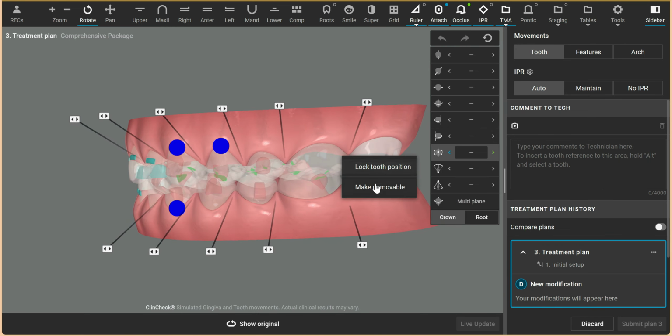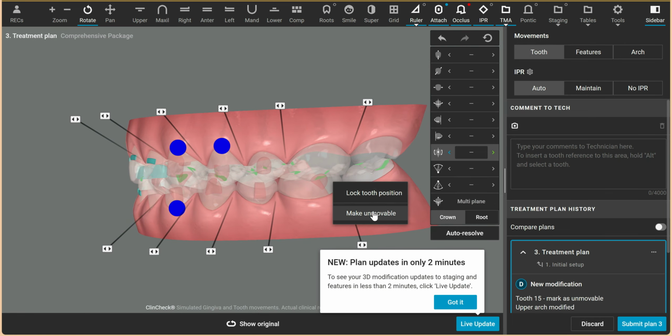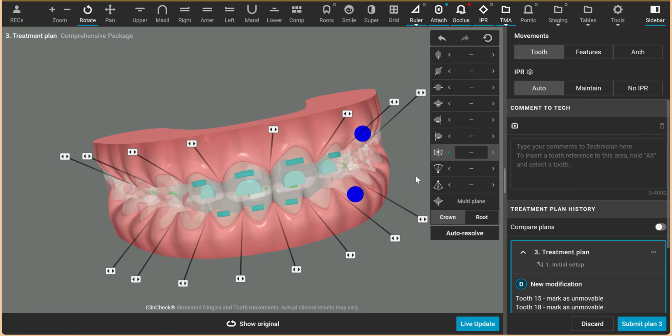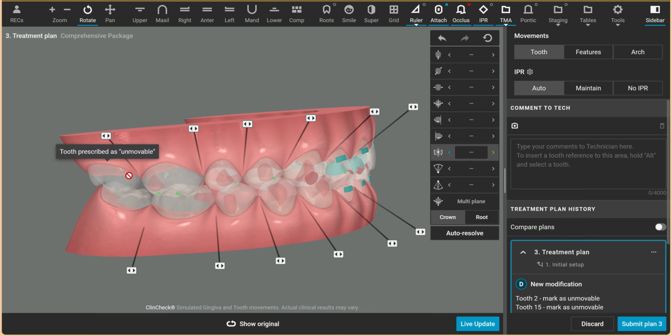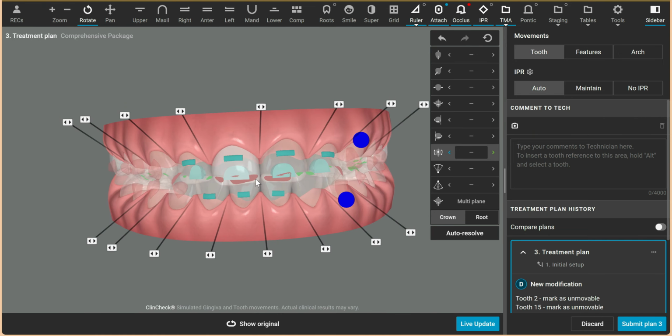What I like to do is I always like to make the second molars unmovable. If there's any little bit of shifting of posterior teeth mesially, you saw that as soon as I did this, the whole upper right side went distal a little bit by just locking in the position of the molars. Now there can be no mesial distal shifting, but as soon as I did that, there are premature anterior contacts.